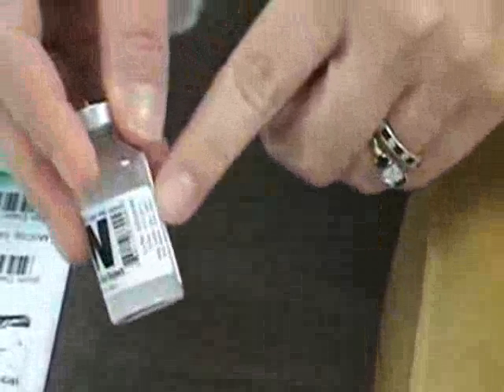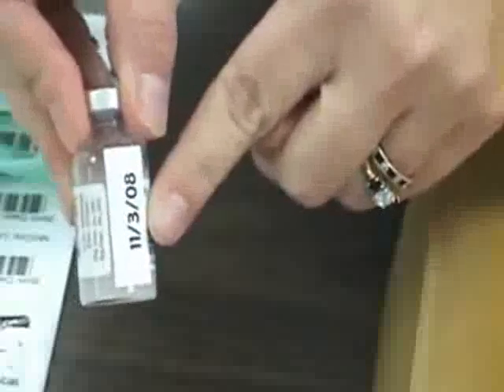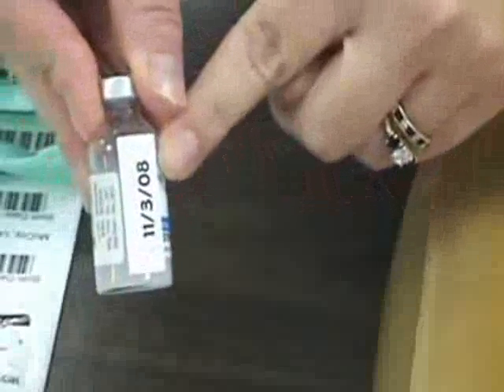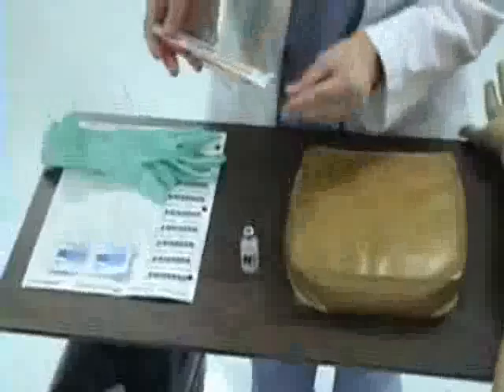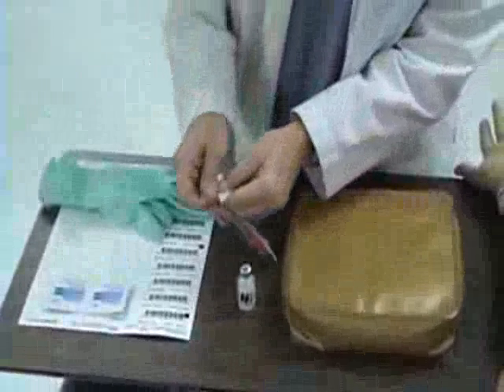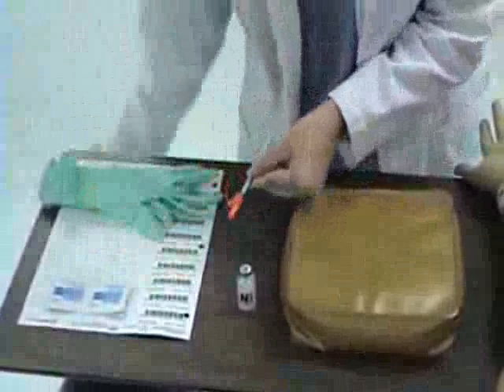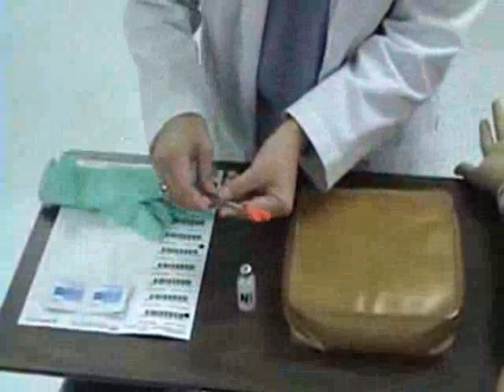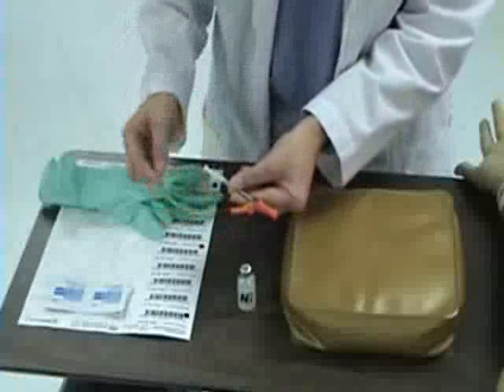Also note that insulin has an expiration date on it and the date that the vial was opened, as insulin is only good for 30 days from the date it was opened. I will want to, at this point, remove the wrapper from my syringe and discard. This particular syringe has a safety feature, a wing on the side, and I can remove it, set it to the side.